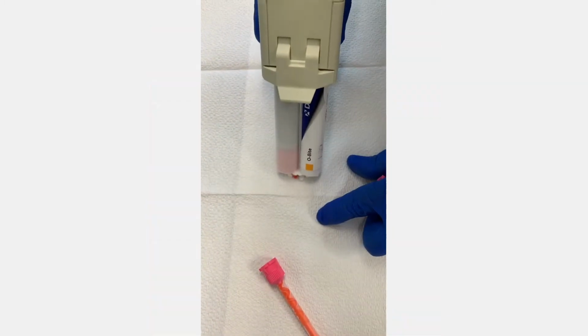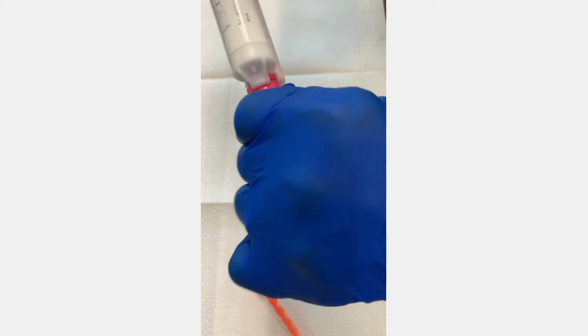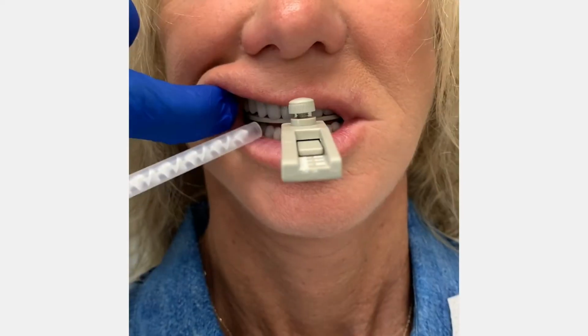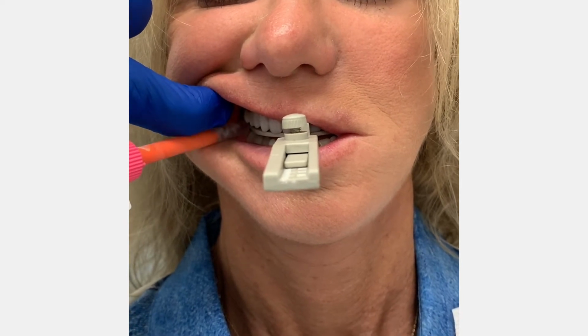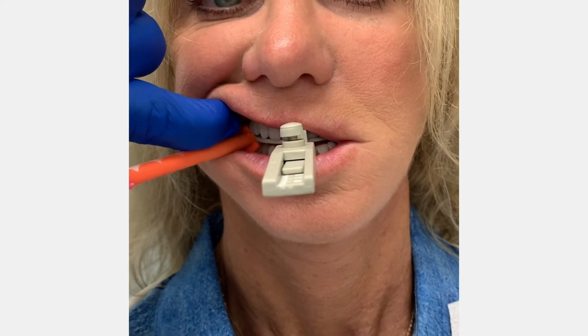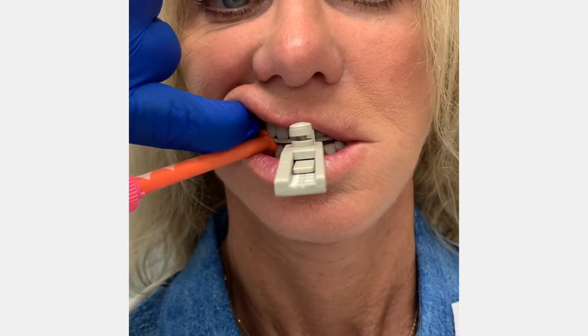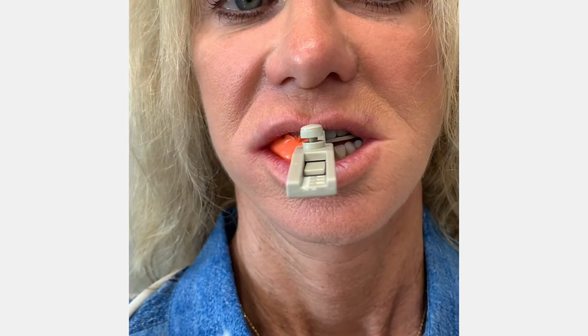Once again, we will be using DMG's O-Bite bite registration. This time we will inject the material directly between the teeth. Be certain that the George Gage and the bite fork are properly aligned with the upper and lower midlines. Now inject the material between the teeth on both sides. Due to the flowability of this material and its superior break resistance, I am able to inject an adequate amount of material between the teeth.